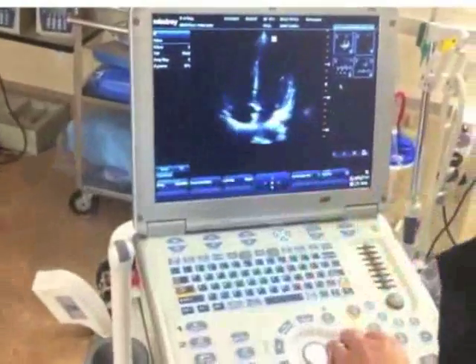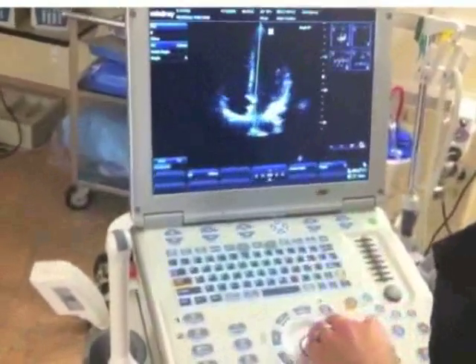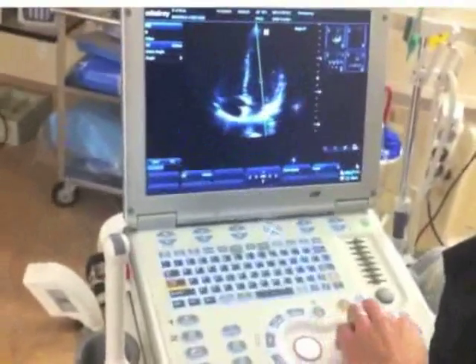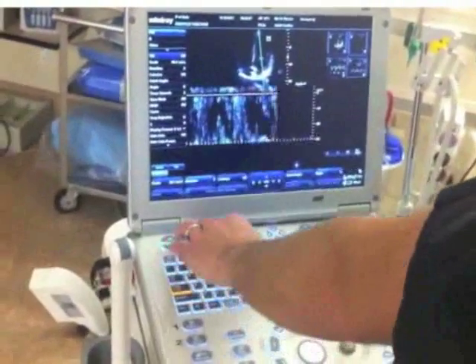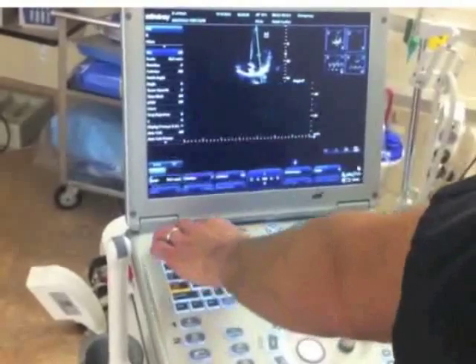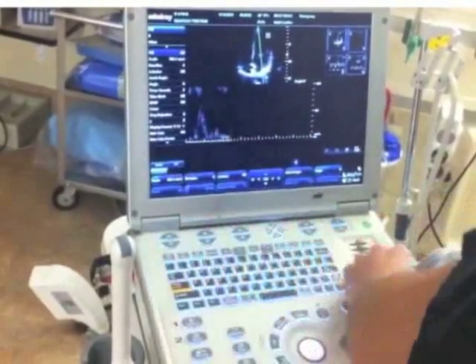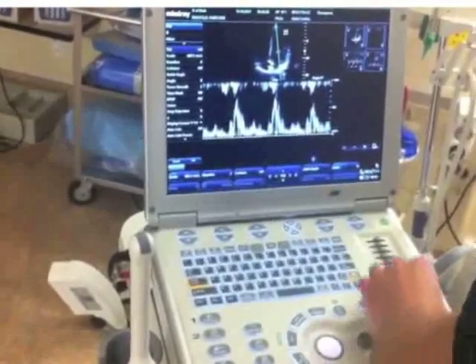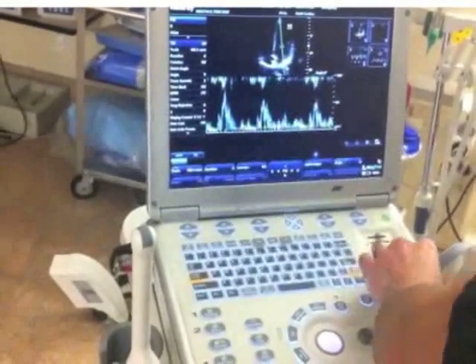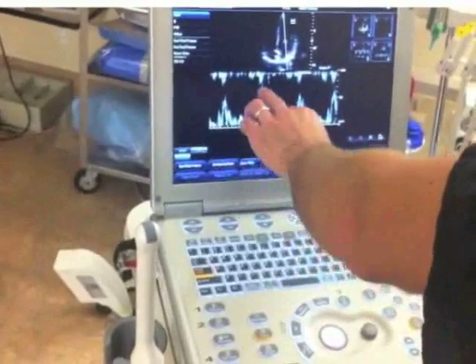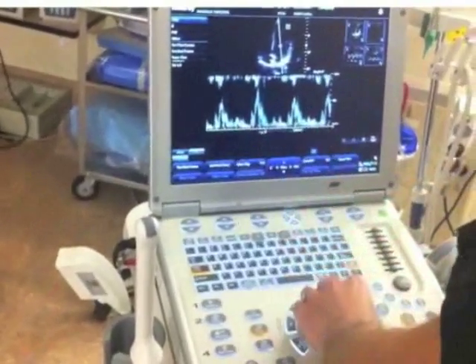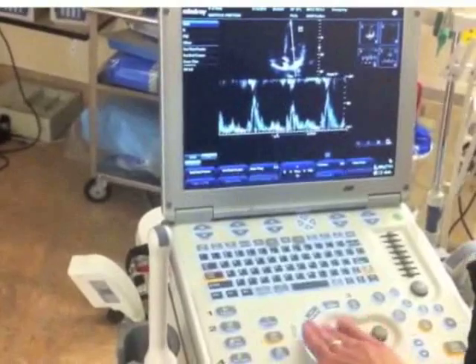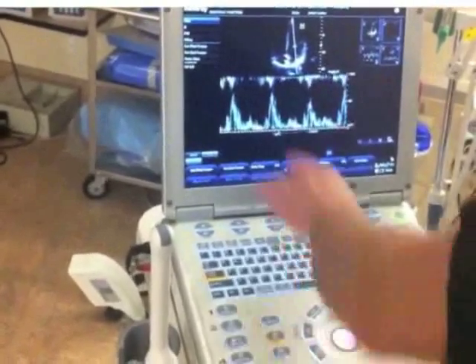So now that we've optimized our 4-chamber view, I'm going to hit the pulse wave button and put the pulse wave gate right at the very tips of the mitral valve leaflets. I'll hit pulse wave again, and once I've fixed my baseline and my scale — you want your scale to about 100 — you'll get an image that looks something like this. Here's a good example of the two waves.